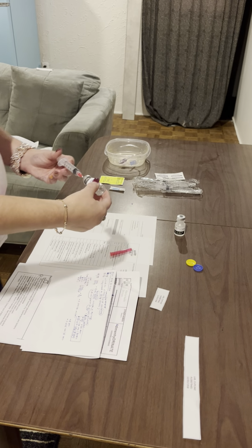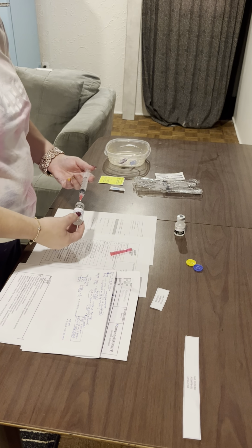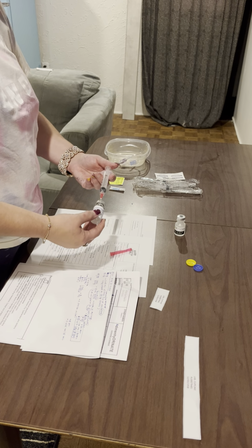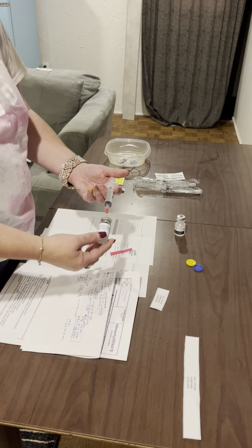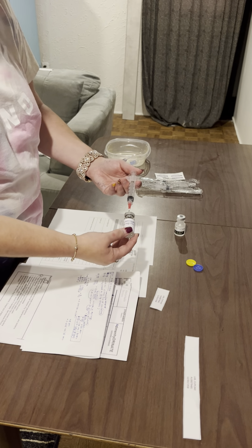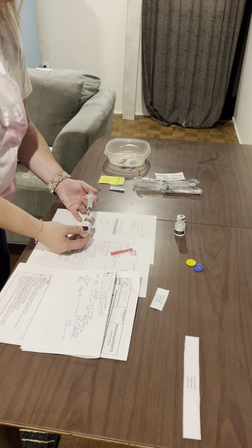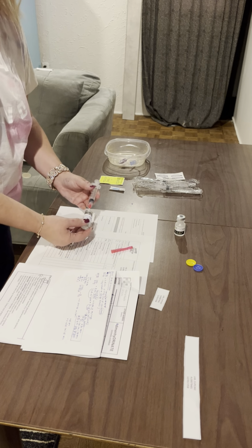So this is a good time to do our second check. The reason we're doing our second check this way and now is because if we have a cosigner, they can come along, clearly see that we have dimenhydrinate and how much we've drawn up. So even though this is a little awkward, I am going to move everything and double check.